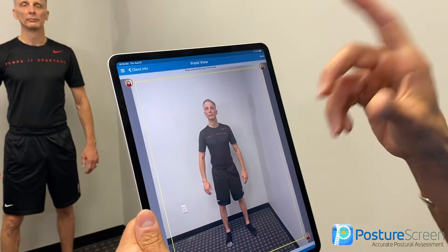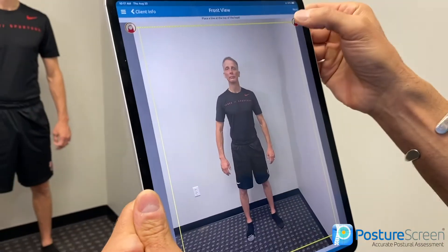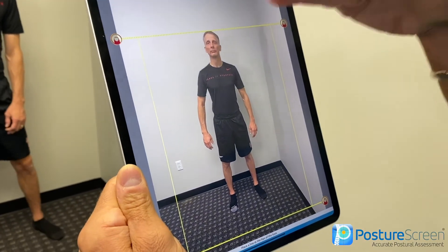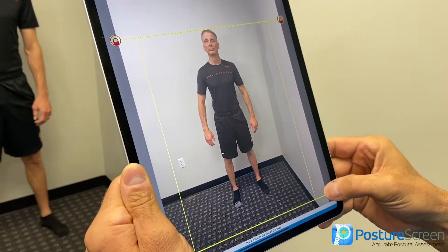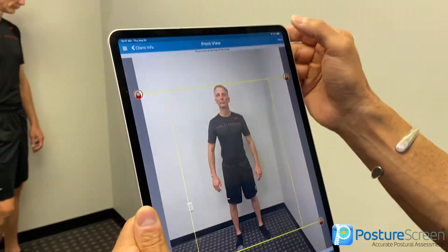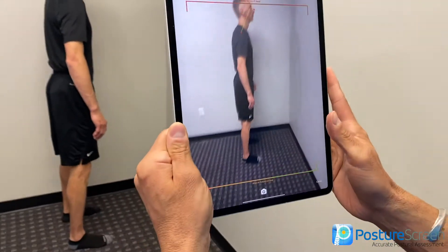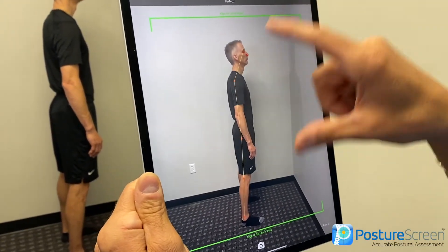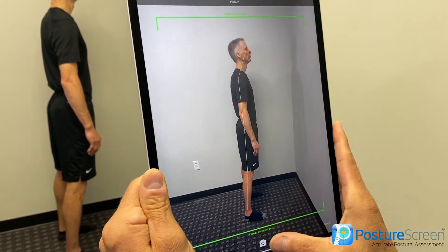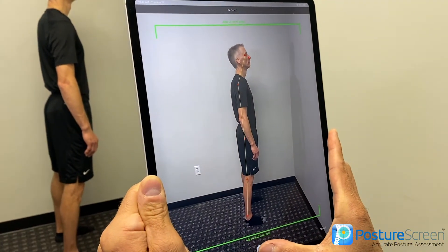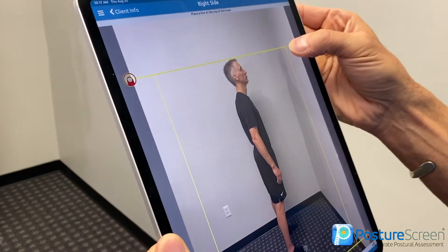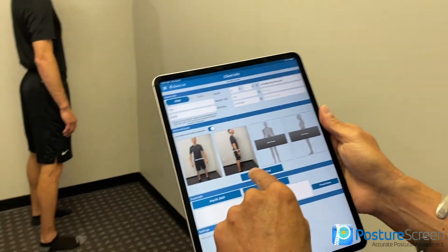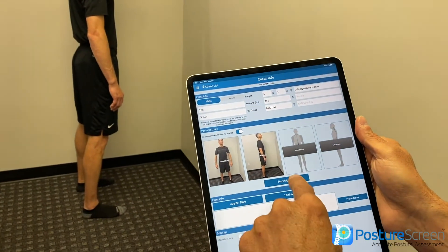This is important regardless of whether you're using augmented reality or not: you want to drag this down to the top of their head, their skull — not if their hair is up here, you want to come down to their skull because it's measuring their height. Then hit next. Now he's turned to the side. Make sure there's no people behind there, otherwise it can track the wrong person. Click here, and then all we have to do is hit Start Digitizing.